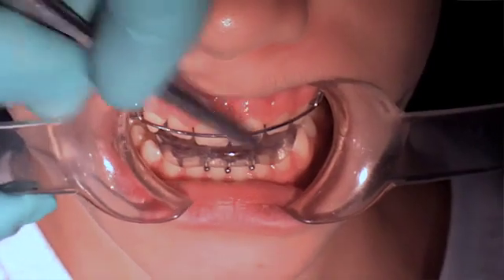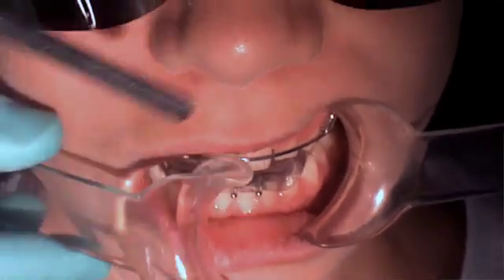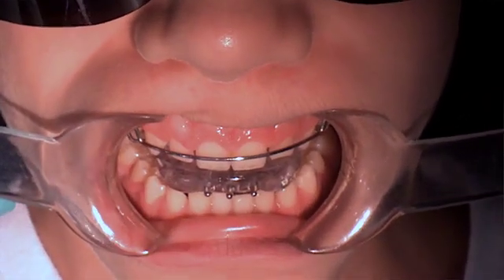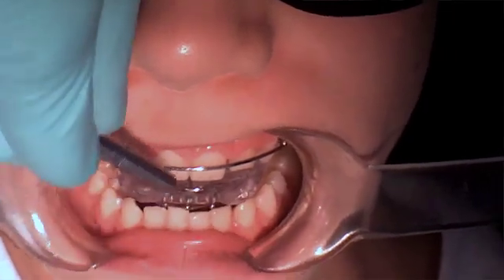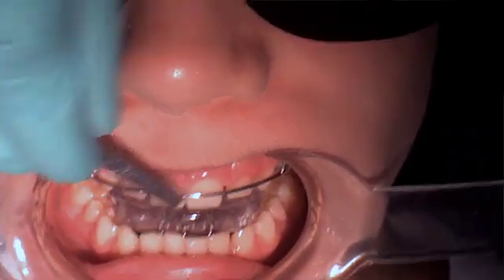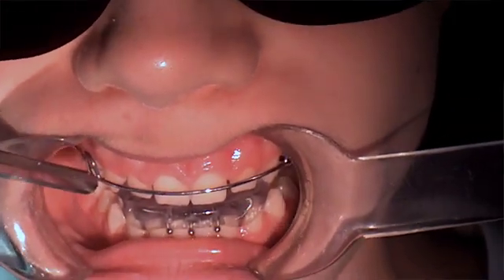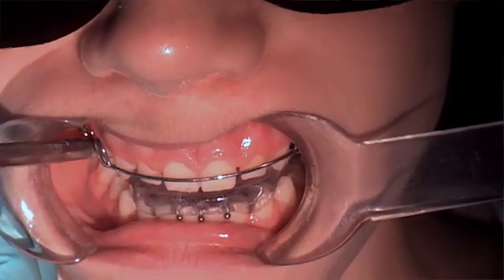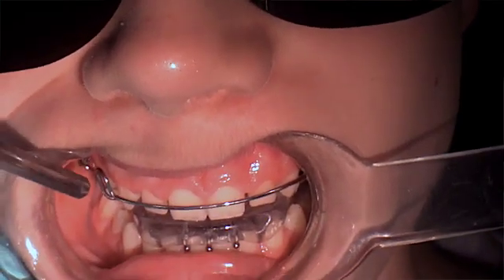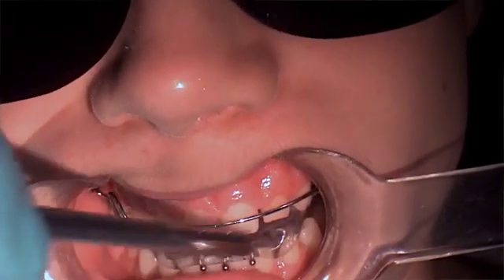You can see the incisal capping — a belts-and-braces approach. I have acrylic as well as ball clasps, much like the twin block appliance. When fitting one of these bionators, you must make sure the acrylic is in contact with the upper incisor. If there's a gap between the acrylic and the incisor, the incisors will over-erupt, which is going to deepen the bite. The lower is unimpeded, allowing the teeth to erupt.